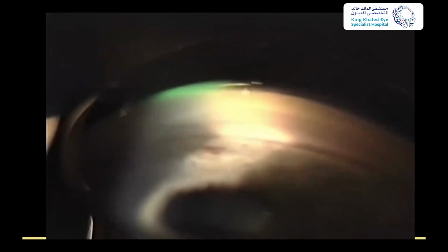So I think I indent everybody I look at pretty much. Partly I like to see the iris in motion. It's just a different view than a static view. This is somebody who is open on one side, closed on the other side, just a video example of the same thing. You can see that when I push, the right side opens up, the left side stays tethered with synechia. When I release, it all looks closed, right? So this somebody probably would do okay with an iridotomy, but is going to be left with some chronically closed angle.